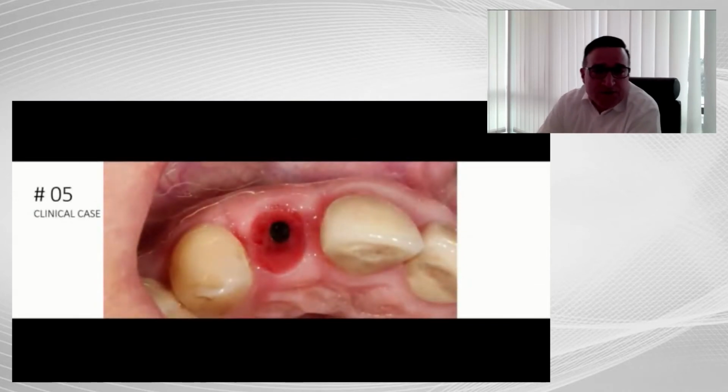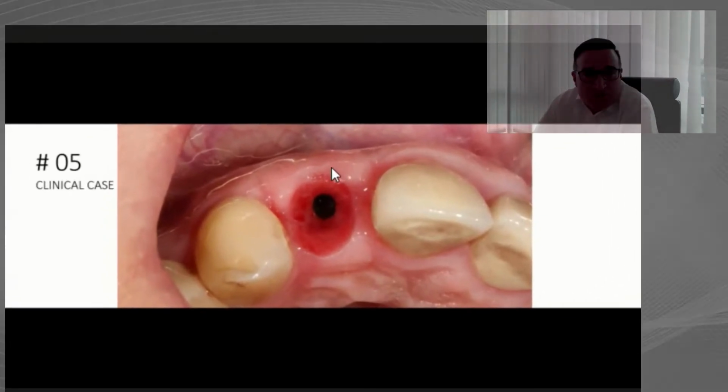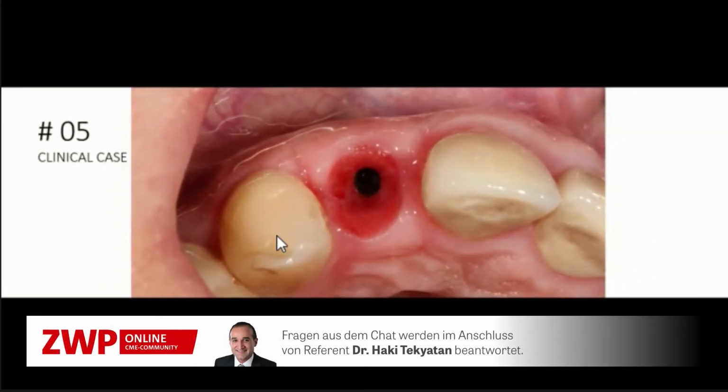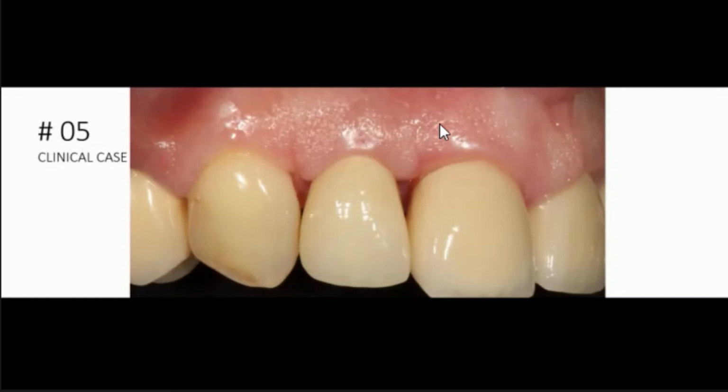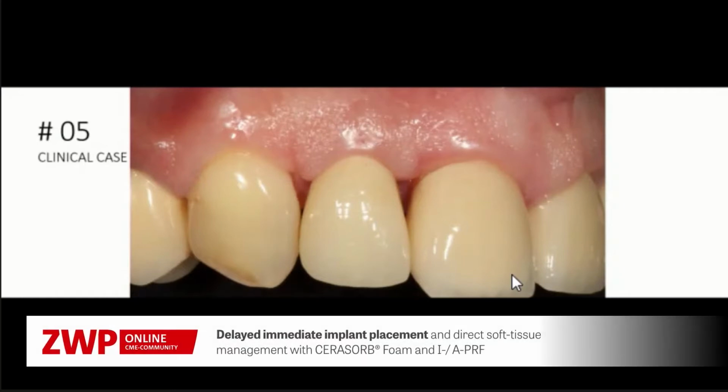After 3 weeks, you can see this picture of the soft tissue conditions. Please note the buccal contour. Above all, the very nice and individualized structure that we can see here. Absolutely no irritating conditions. Here you can see the final view of the final crown restoration here too. Completely non-irritating conditions of the soft tissue.